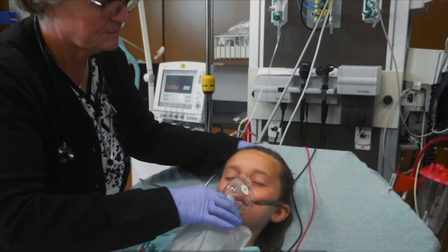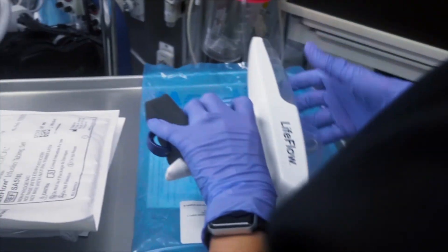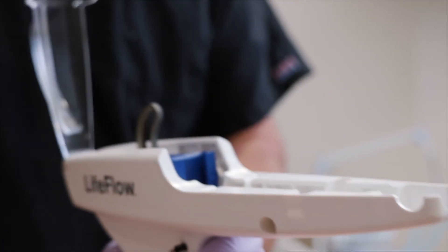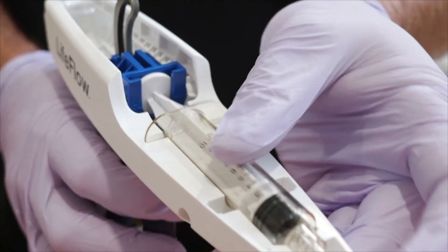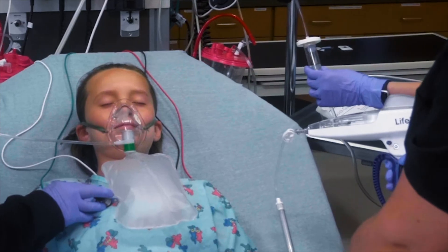LifeFlow is a handheld rapid infuser for critically ill patients who require urgent fluid delivery. LifeFlow protects the syringe from inadvertent contact, which minimizes the risk of bacterial contamination of the syringe.